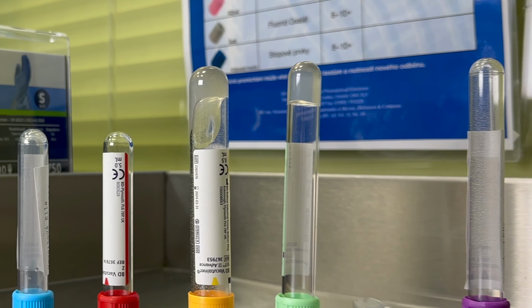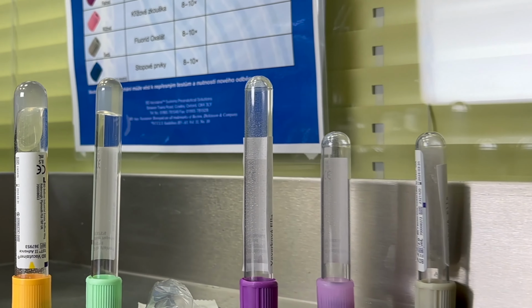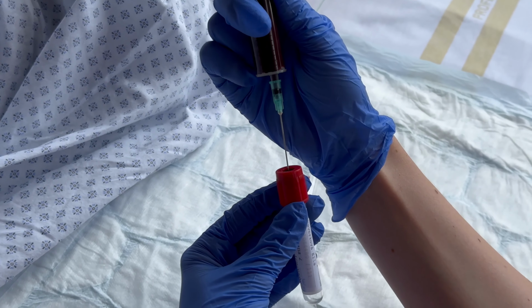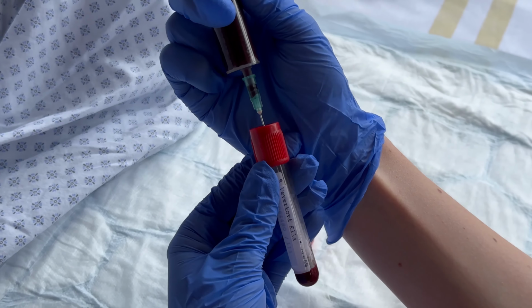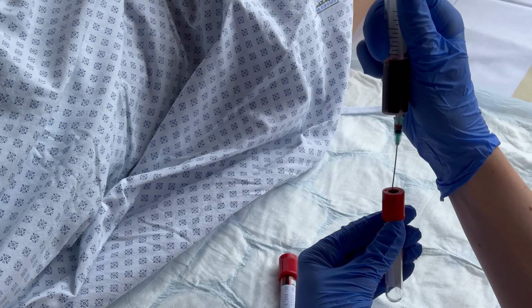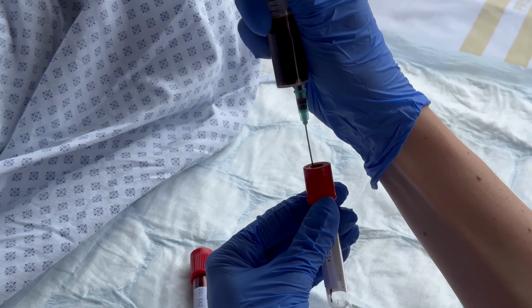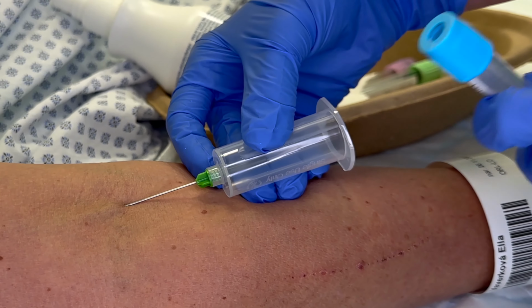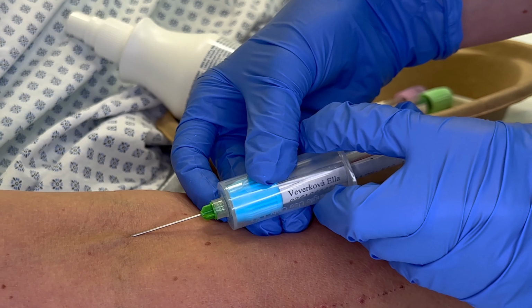The collection tubes contain an exact amount of anticoagulants specific to prevent the influence of the examination results and simultaneously prevent clotting of the samples. When inserting the vacuum collection tube into the holder and piercing its stopper, the collection needle may become contaminated with traces of reagent on the inside of the stopper, which can affect some results. Therefore, tubes are collected in an order that minimizes the formation of these errors.